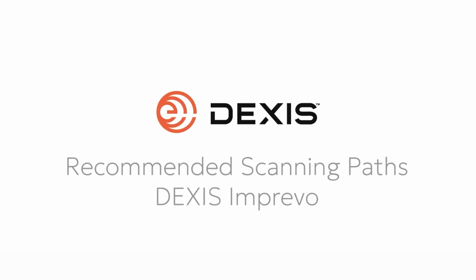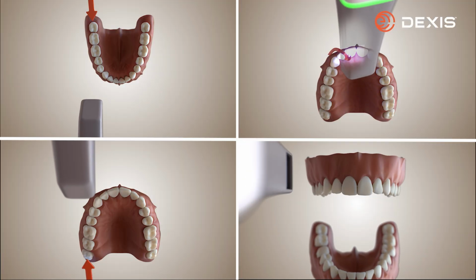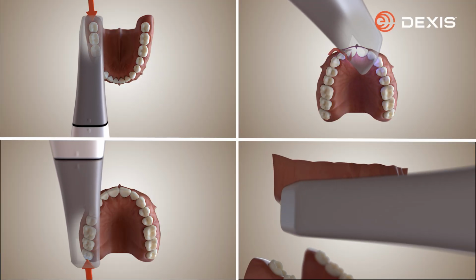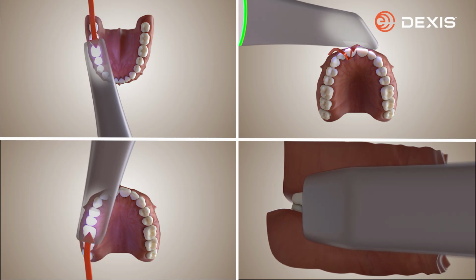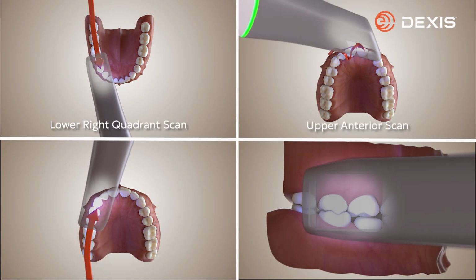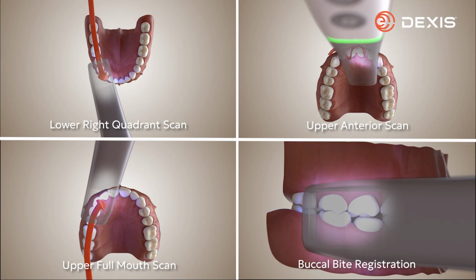Welcome to a DEXIS Imprevo recommended scanning paths demonstration, designed specifically for clinical team members. In this fully animated guide, we'll walk through the 4 primary scan types performed with the Imprevo intraoral scanner: quadrant scans, anterior scans, full mouth scans, and buccal bite registrations.